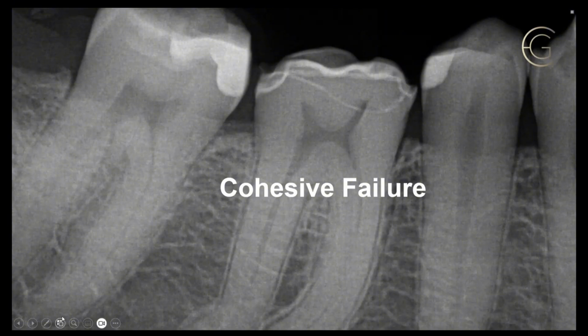So I'll come back to my thing on that, but you really want to check with the Troll foil, and you want to make sure you don't have any working or non-working interferences. But with the dentin, this patient is going to be in a lot of pain, and I'm going back to my point here, that most failures with the MMPs that we talk about, the matrix metalloproteinases that Franklin Tay coined, which will disrupt the bond to the dentin, happen at about the 3-year mark. Okay, 3 to 5 years. So we're way past that.